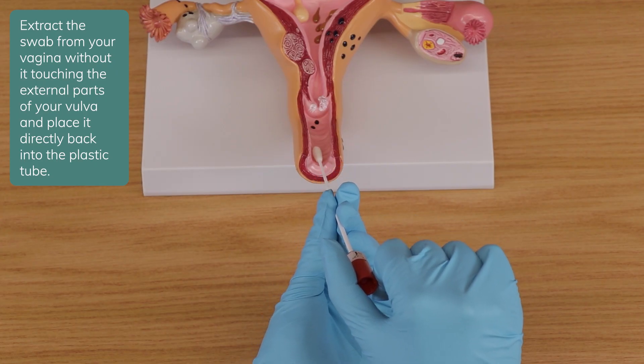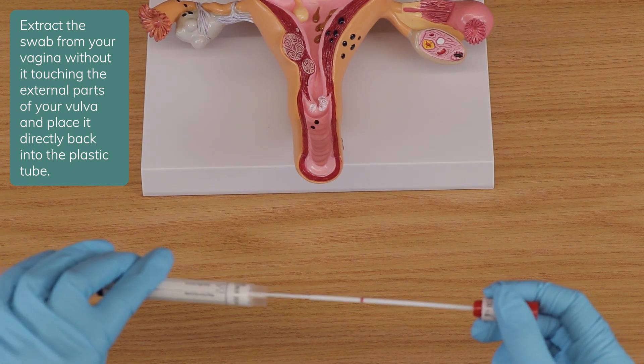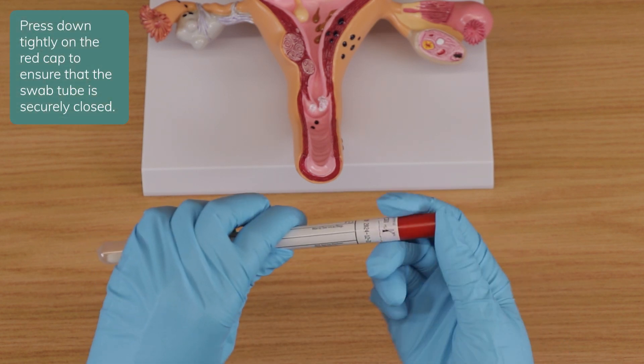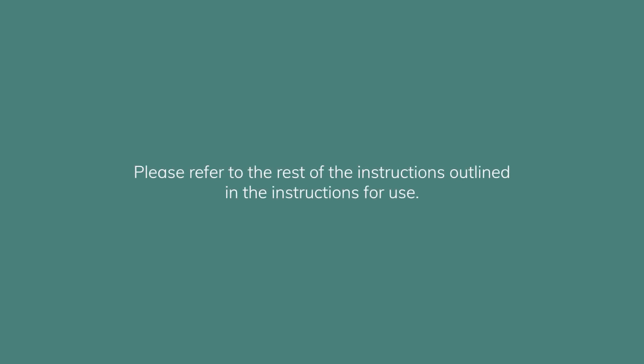Extract the swab from your vagina without it touching the external parts of your vulva, and place it directly back into the plastic tube. Press down tightly on the red cap to ensure that the swab tube is securely closed. Please refer to the rest of the kit instructions outlined in the instruction for use.